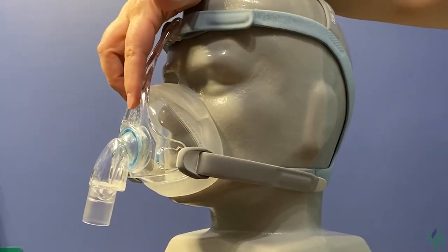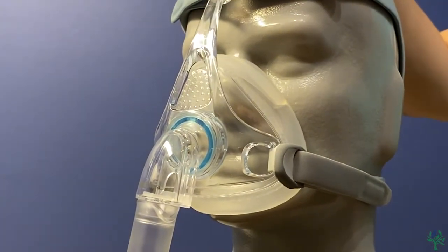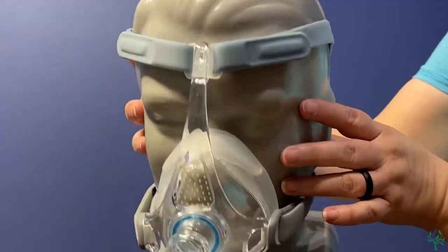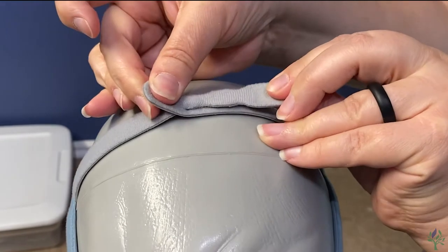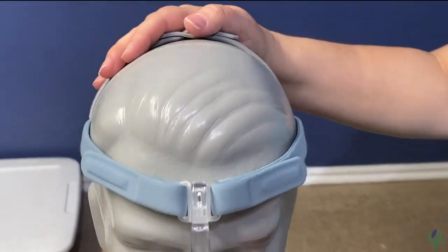Now this mask does vent out the front here, and that's the only place that you want to feel that air coming through. Now if you feel like everything here needs to be adjusted up on your face, you're going to come up here to the top strap. You'll want to go ahead and undo these two straps on top and go ahead and either tighten or loosen accordingly for where you want it to sit on your face.